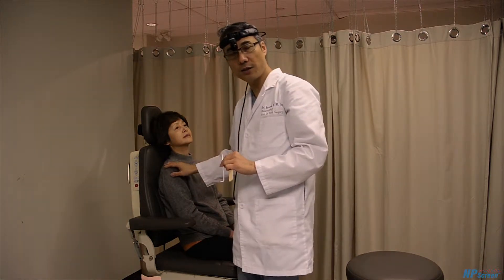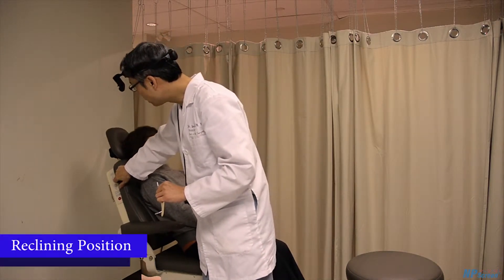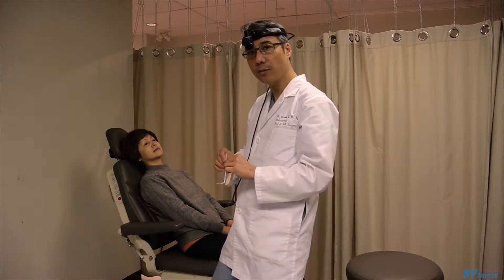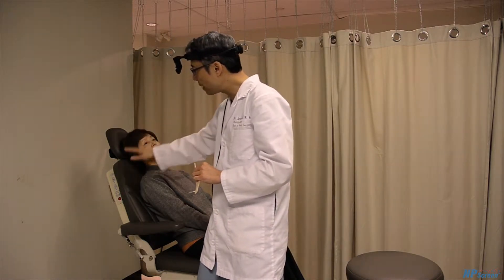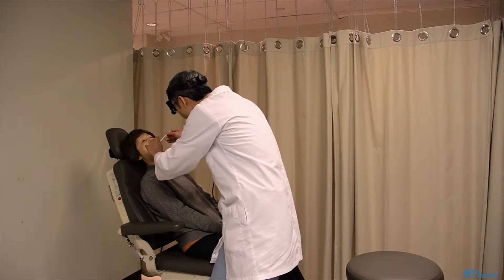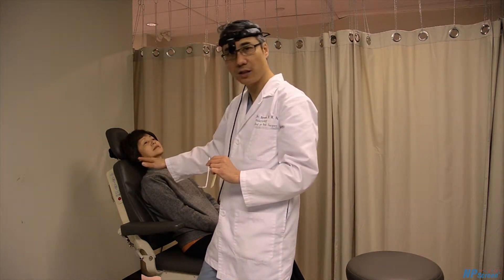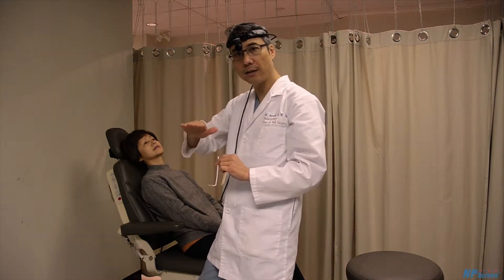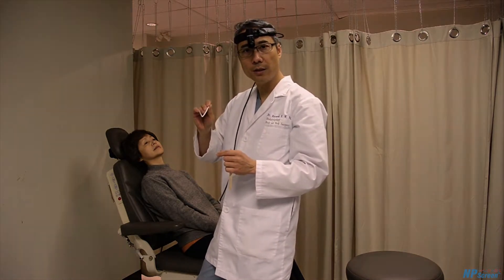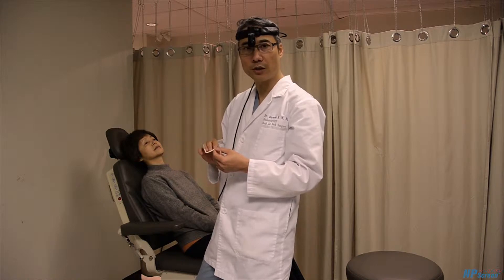Another position I find very useful is to recline the chair as if you're performing a dental procedure. That way the patient tends to feel a little bit more comfortable, resting at the back of the chair. Then you do the same thing: open the mouth, put the tongue depressor in, and do the brushing. A slight disadvantage of this position is that the soft palate tends to fall back toward the back of the oropharynx, making it a little more difficult for the brush to insert into the nasopharyngeal area. But in most situations, those three positions will give you optimum brushing and collections.